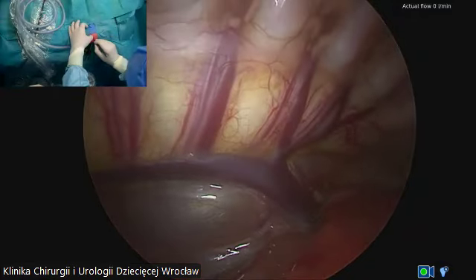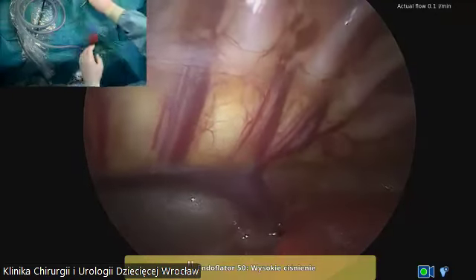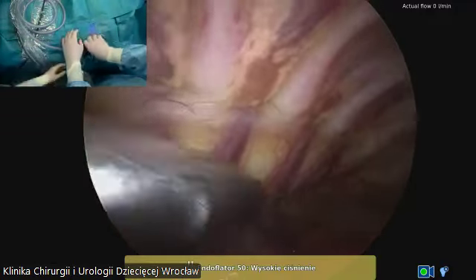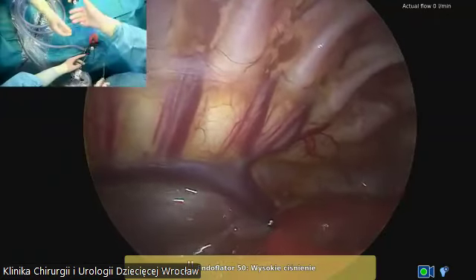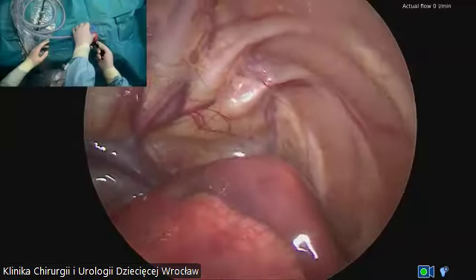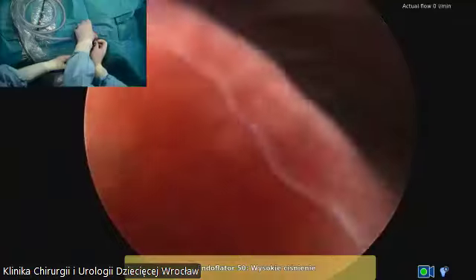So right now I will put 2 other trocars. Okay, there are 3 millimeter trocars. You can see one, another one. It's very difficult to place the trocar that is in the axillary fossa. You have to go under the scapula and then enter the chest, like here.